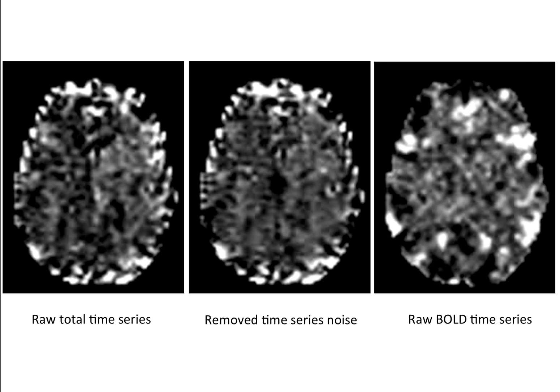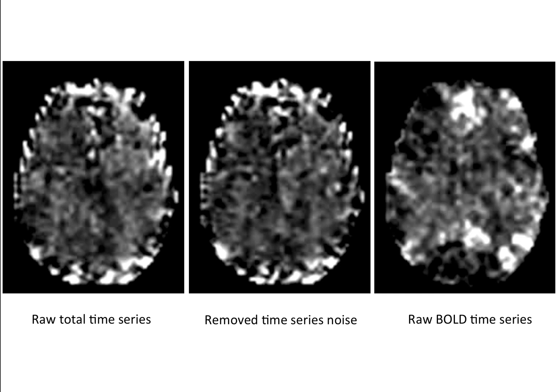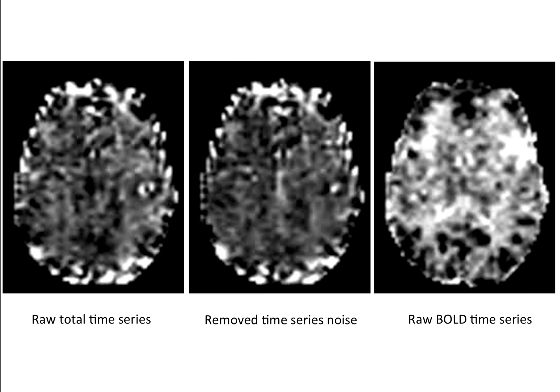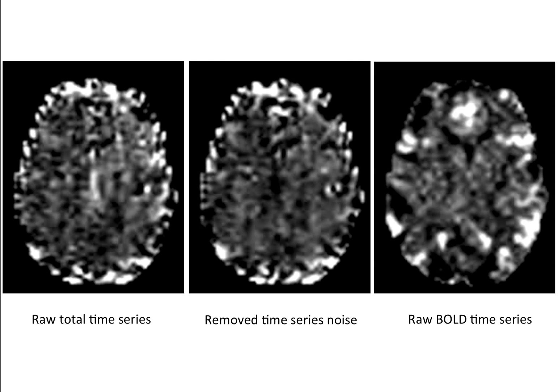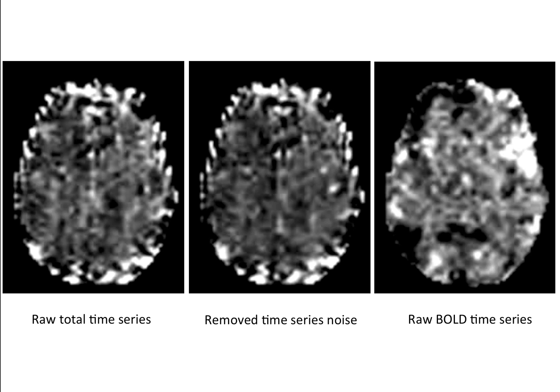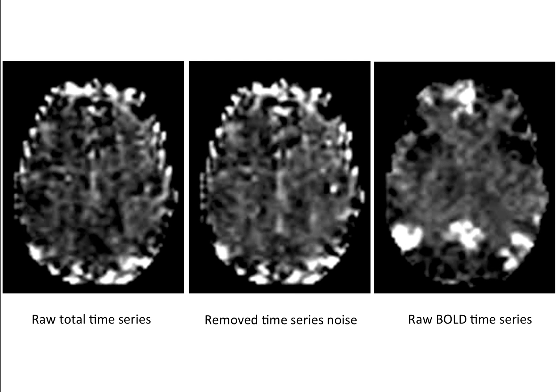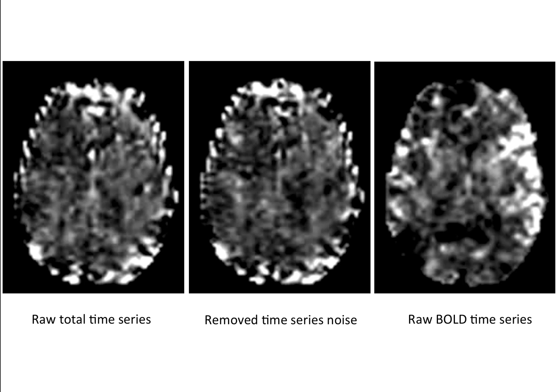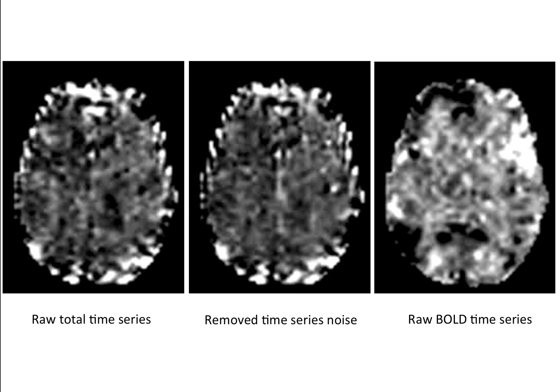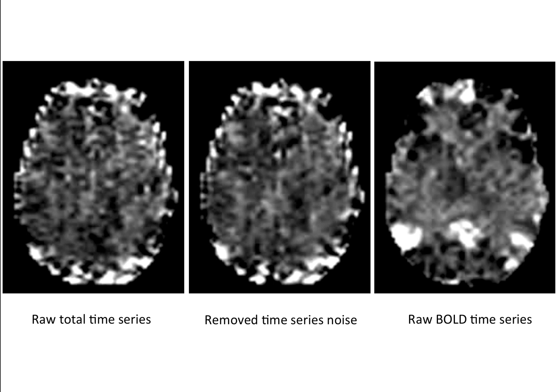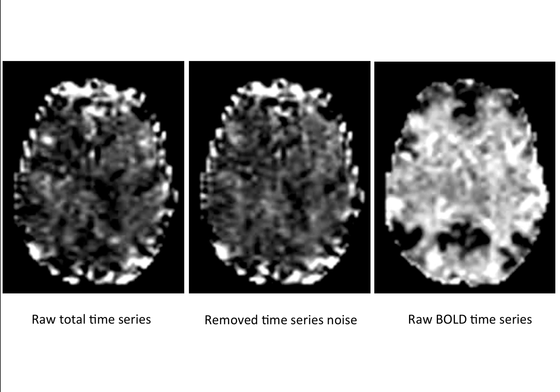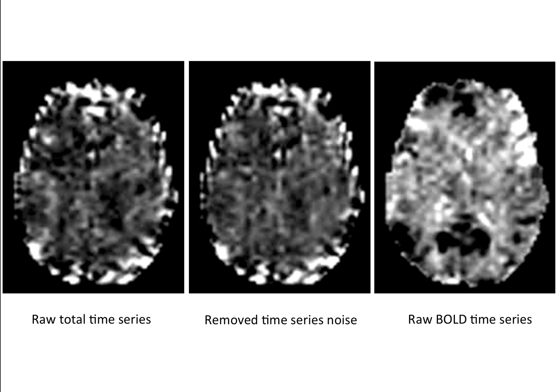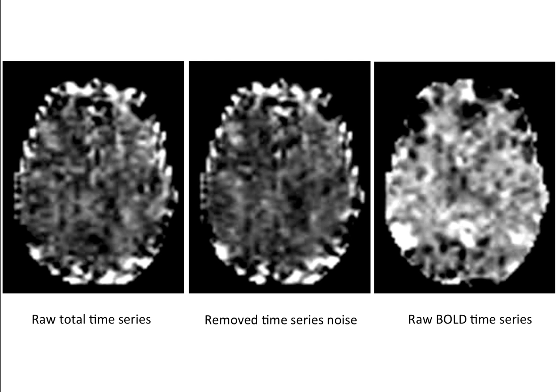While there may still be some residual respiration artifacts, you can now much more clearly see what looks like spontaneous neural activity. You can see the default mode network pop up — temporal lobes becoming activated, parietal and frontal areas becoming active — an oscillation across networks showing activation. There's no additional processing other than regressing out the non-BOLD signal; no sliding window correlation or anything like that. This is just the raw time series with noise regressed out.